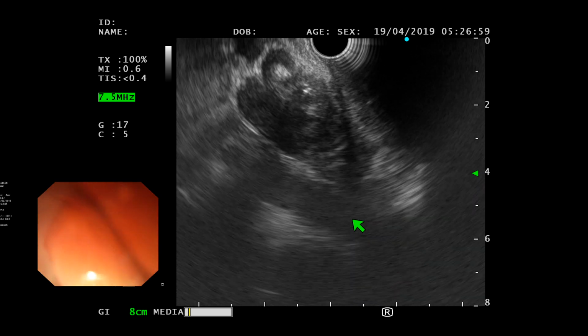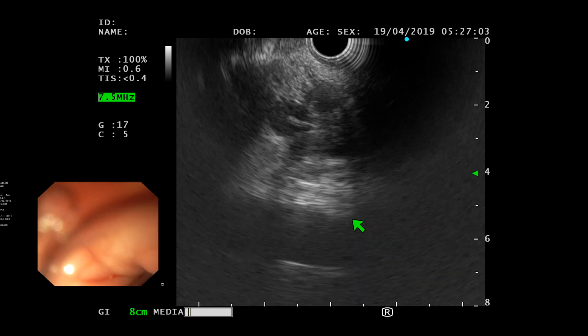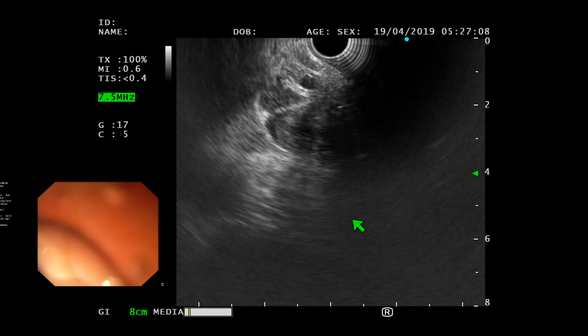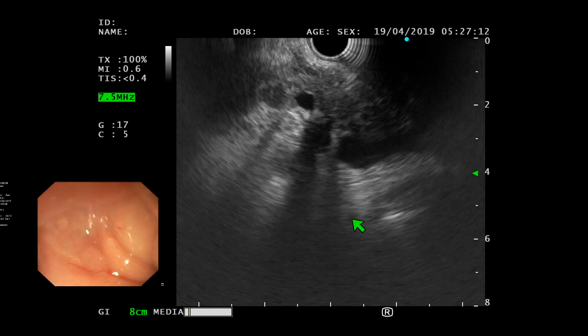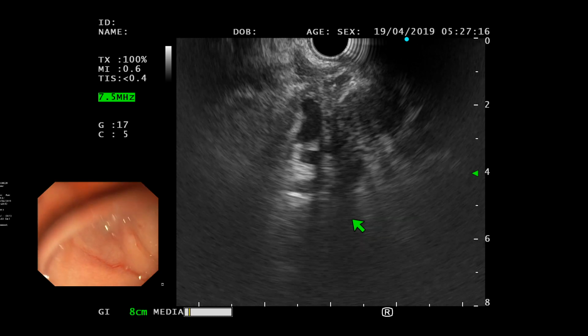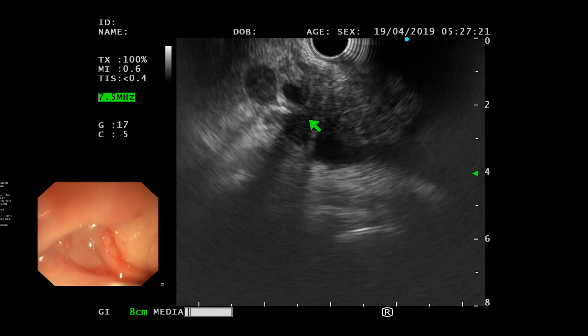When did she have an ERCP? I think there is some degree of obstruction there, really. I think that was reported, that there may be some duodenal obstruction. Yeah. There is some, I'm afraid, and that's the mass there, which is completely engulfing the artery as well here.